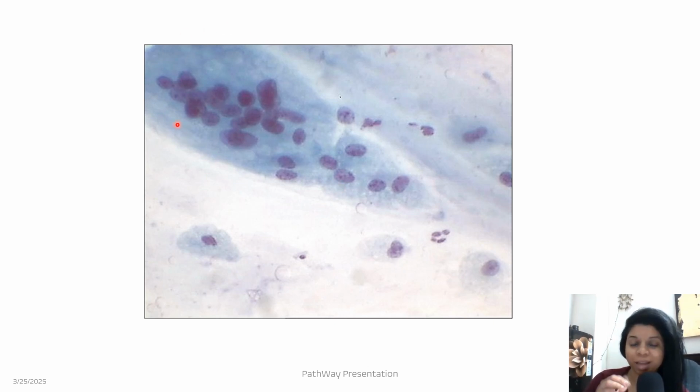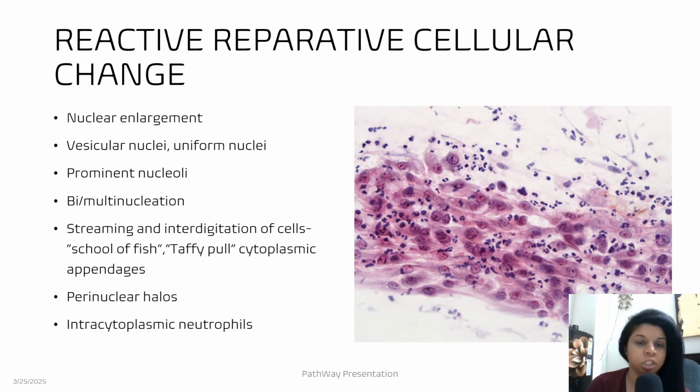And I'm not saying that granuloma won't be present in a pap smear. In extremely rare cases, when there is TB in the cervix, then only you will get granuloma. For that also you need very good clinical correlation. So when you get such a smear, don't be afraid. I did an extensive study when I got such a thing in the initial days. They are not granuloma, they are just a multinucleated histiocytic collection.